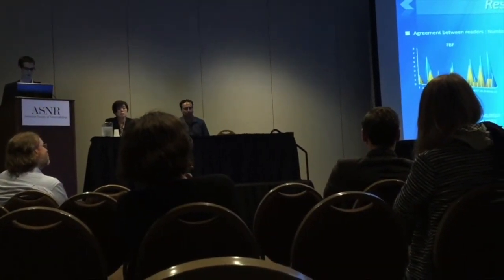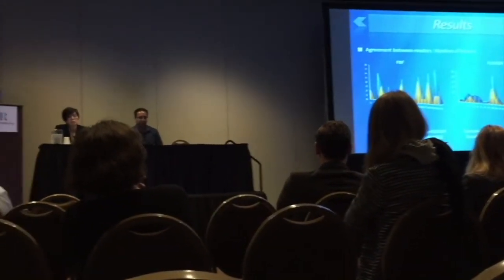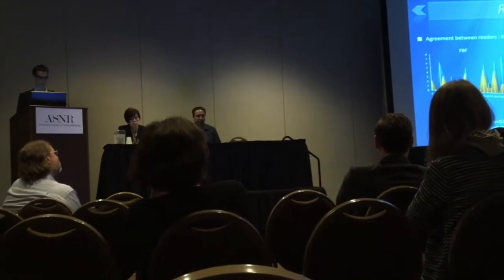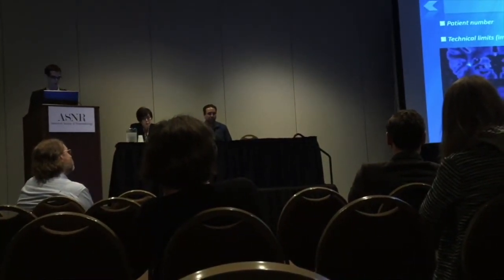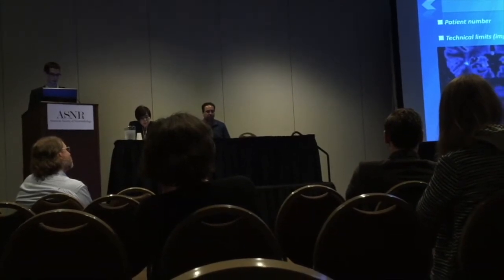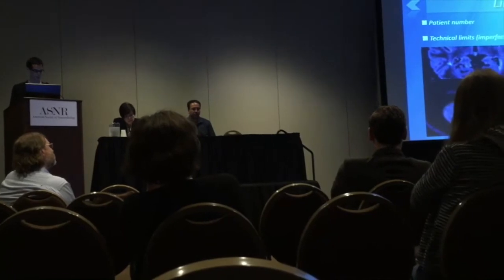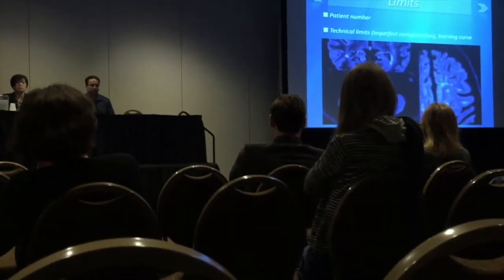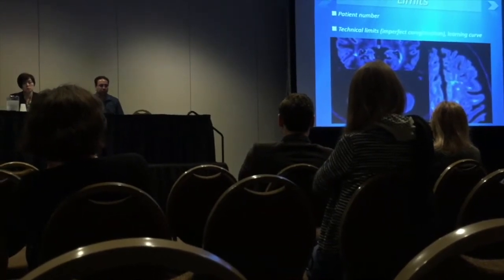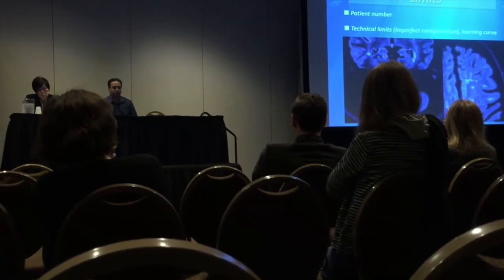In terms of agreement between readers, the agreement for FLAIR fusion is higher than the agreement for frame-by-frame comparison. The study has some limits. With a higher number of patients, the difference in the number of new lesions detected could be significant. The technique has some limits too. Some technical issues like imperfect co-registration are easily recognizable by the double contour appearance of the image.